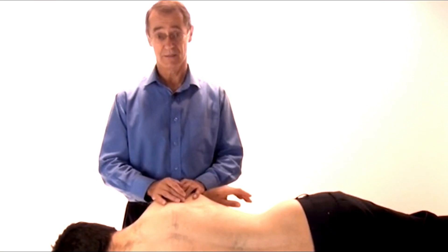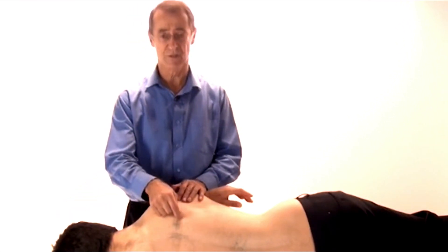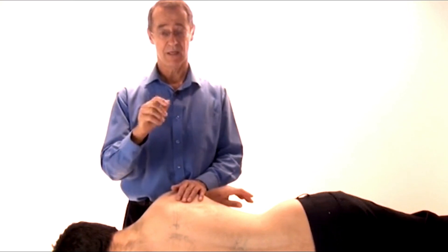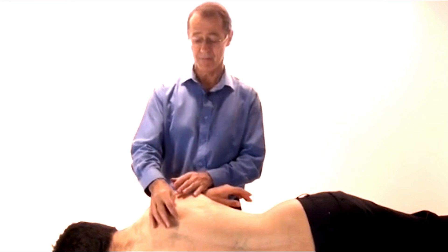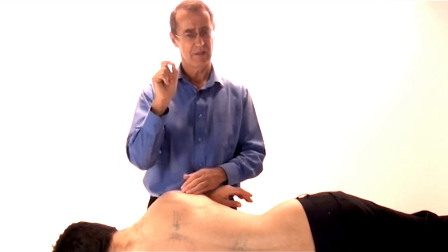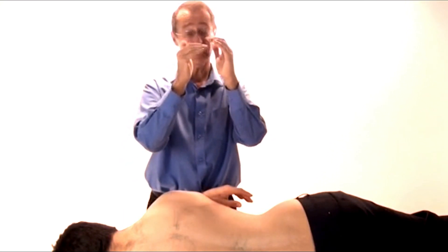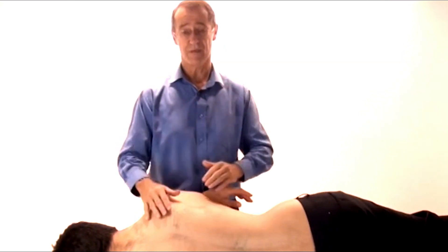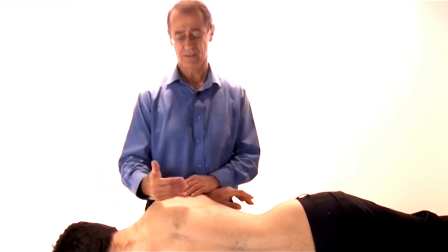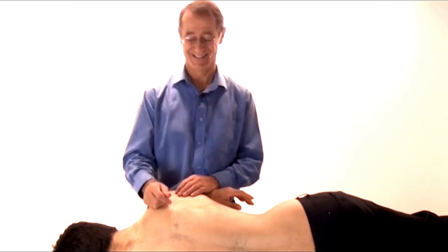If you do puncture a lung, it's not the end of the world, but what will happen is the person will say it feels like a little sharp pain as they breathe, and then over the next number of hours they may become a little more short of breath as the lung collapses down. Because it's a tiny needle, in almost 100% of cases the lung will collapse less than 10%, will heal itself, and will gradually reabsorb on its own over a week to 10 days. But you're doing this to treat somebody — not to cause them extra anxiety, and yourself extra anxiety. So this is an area to beware.